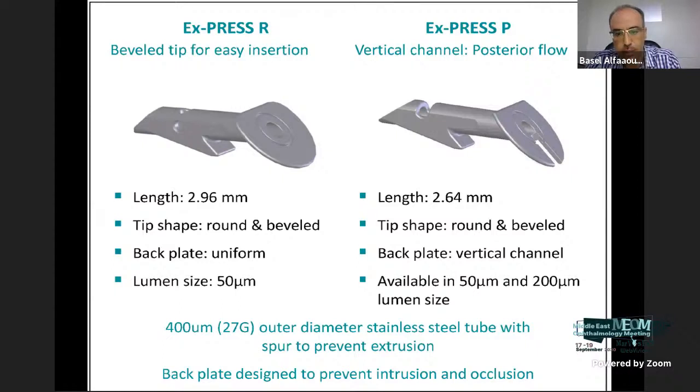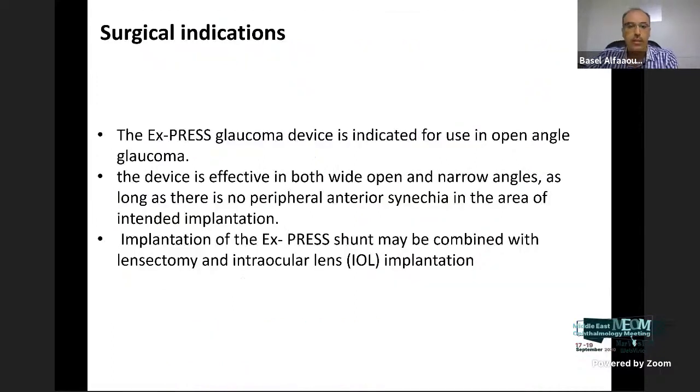The very, very important thing in this implant is the lumen. The lumen of 50 microns will regulate the outflow of the aqueous from the anterior chamber to the subscleral flap. We have two lumens, indeed, the main one and one side port lumen.